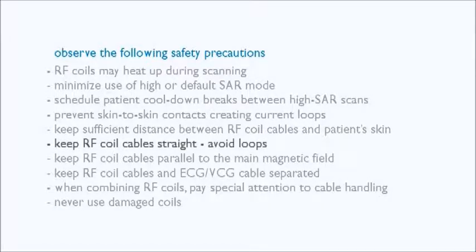Keep RF coil cables straight. Avoid loops. Keep RF coil cables parallel to the main magnetic field. Keep RF coil cables and ECG/VCG cables separated. When combining RF coils, pay special attention to cable handling. Never use damaged coils.